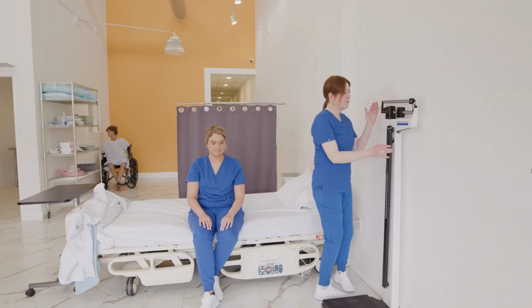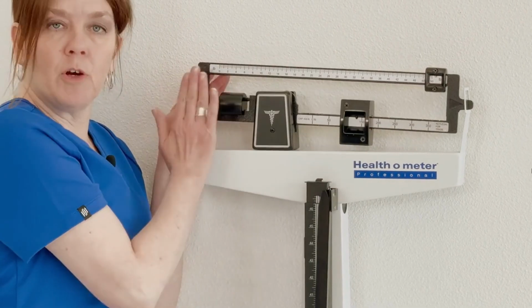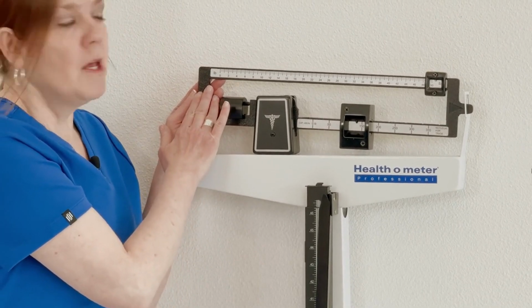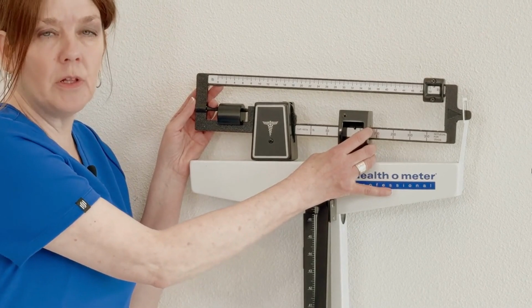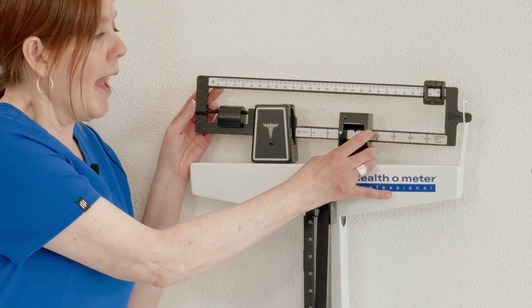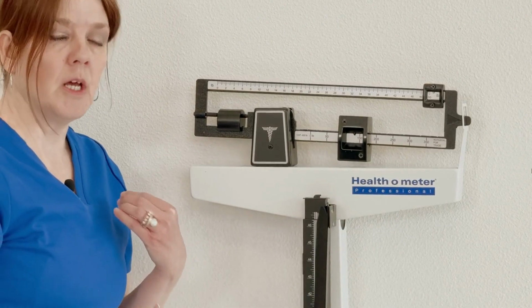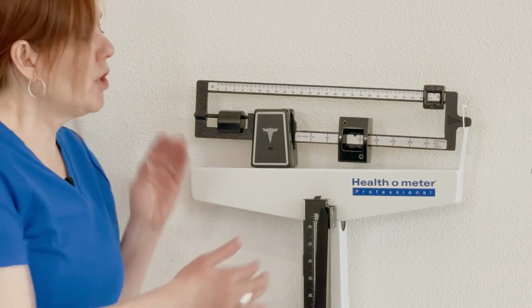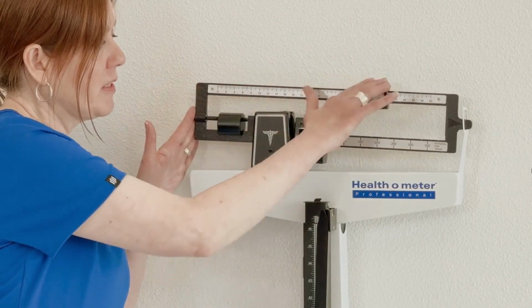For the scale, you want to make sure that both of your blocks are on 0. If you'll note, when you come in, the scale is going to be left on the last weight that was taken. And if you put your patient on the scale and then zero it, you will not get a correct weight. So you want to make sure your scale is on 0 before your patient stands on the scale.